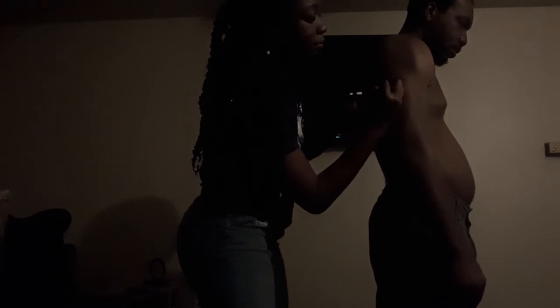I'm going to take my pen and mark his tricep. I'm going to take the skin caliper, make sure it's set at zero. Make sure that the measurement of the skin caliper is facing upward. Pinch his skin, get a good grip to measure the fat. That was 5.90.